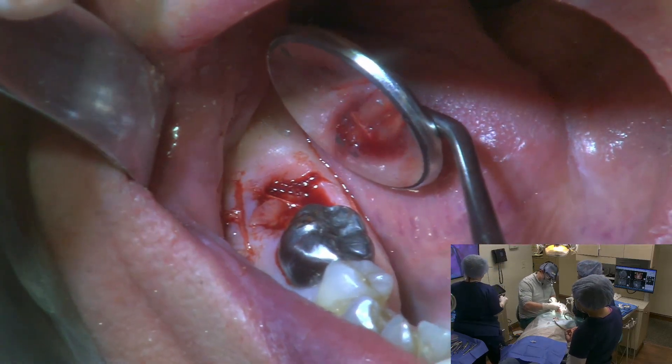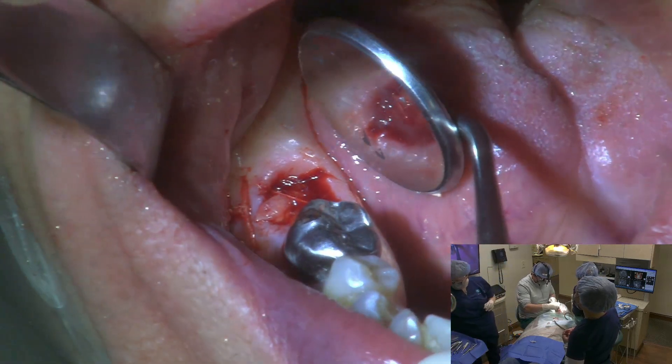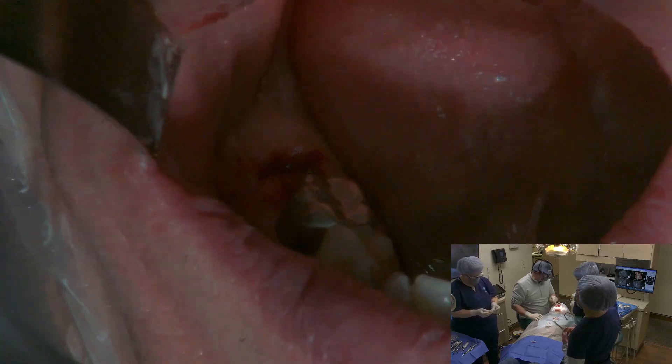Now we've got our crisscross suture right over top of that — that looks absolutely gorgeous. Now we've just got to let him heal for four months. Alright, my friend, good job.